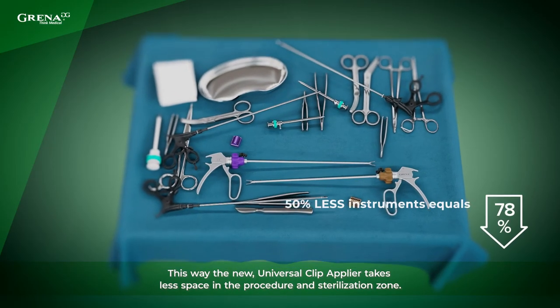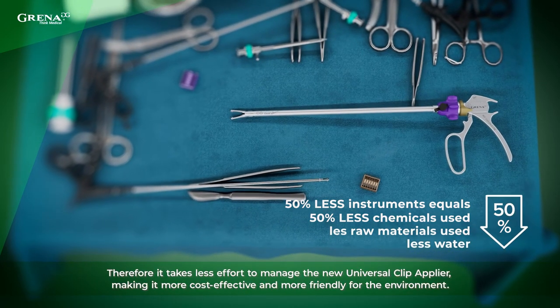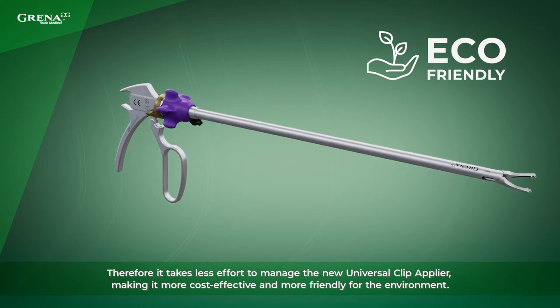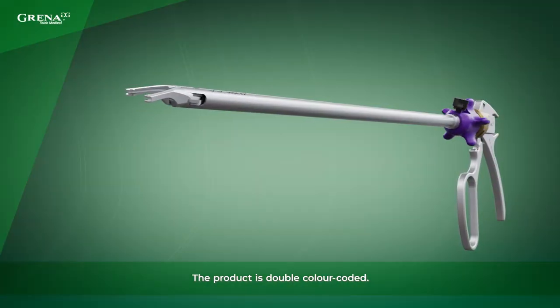This way, the new Universal Clip Applier takes less space in the procedure and sterilization zone. Therefore, it takes less effort to manage the new Universal Clip Applier, making it more cost effective and more friendly for the environment. The product is double color coded.